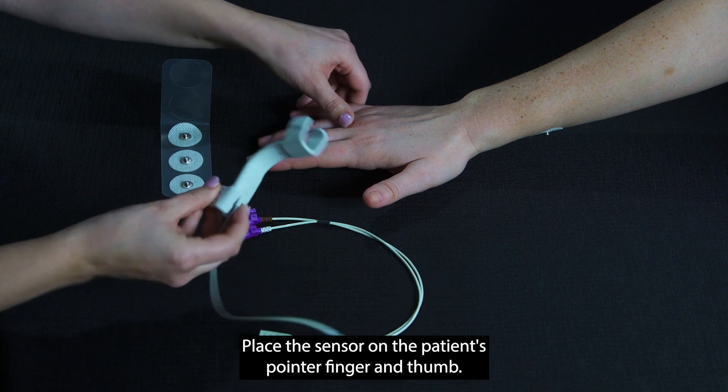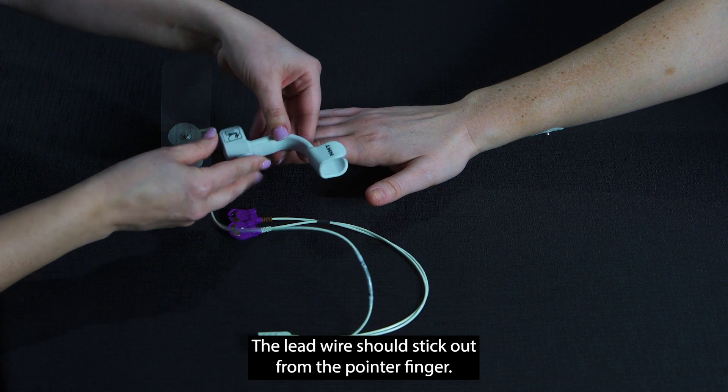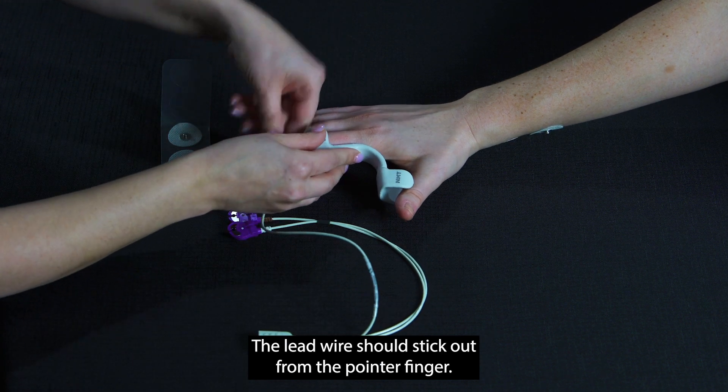Place the sensor on the patient's pointer finger and thumb. The lead wire should stick out from the pointer finger.